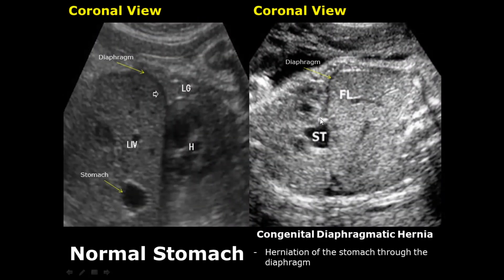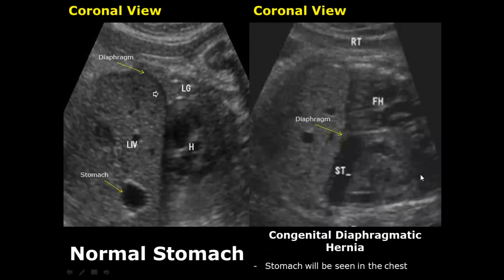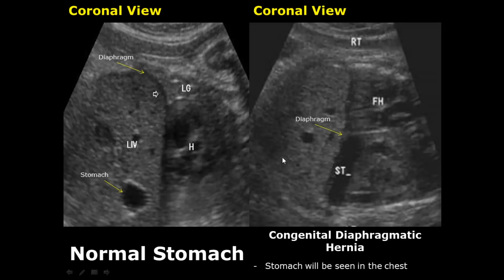In congenital diaphragmatic hernia, there is a defect in the diaphragm which allows abdominal organs to protrude through the defect and enter the chest cavity. Mostly the stomach is seen protruding through this defect. In this coronal view, the stomach is herniating through the diaphragmatic defect. In this image we can see the stomach in the thoracic cavity, with the heart displaced towards the right side because of the herniation. The stomach is no longer seen in the abdomen. Seeing the stomach in the thorax is a strong sign of congenital diaphragmatic herniation.